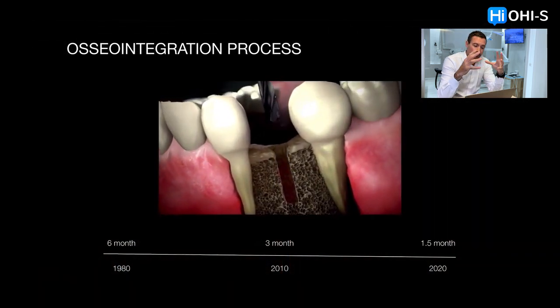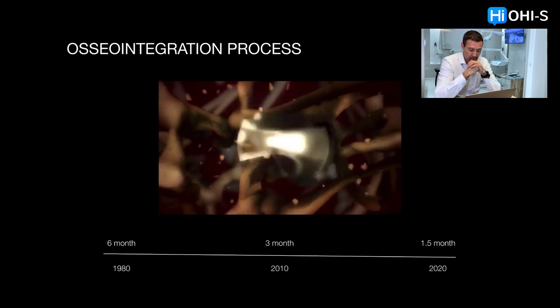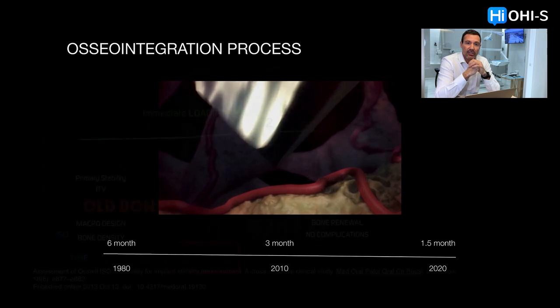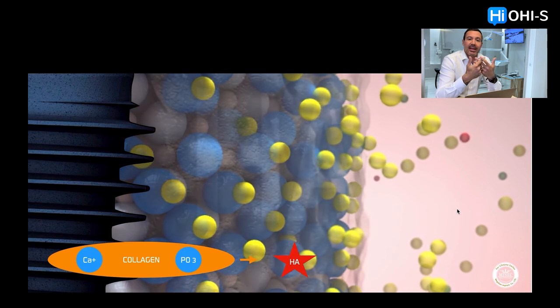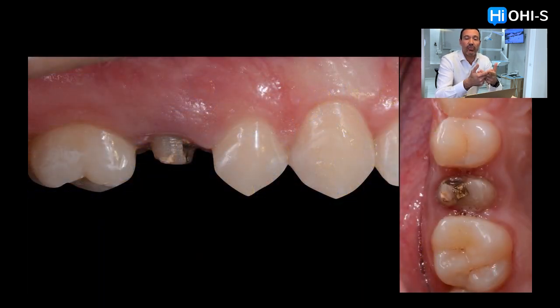These are the factors involved in immediate loading concepts to be successful in our treatments. The fast and quick osseointegration concept: it is important to know that the faster an implant surface osseointegrates, the fewer potential complications we are going to face derived from non-mature bone around our implant.